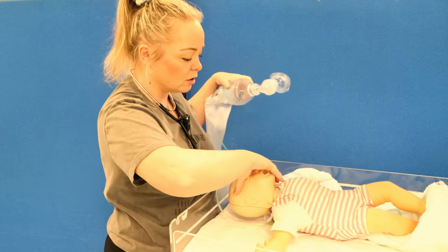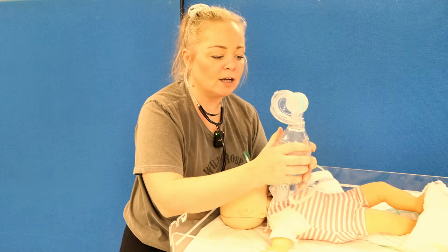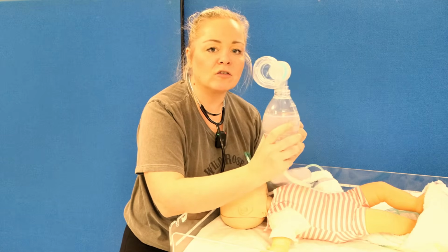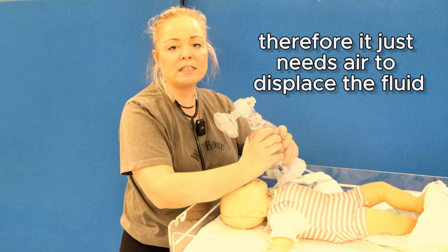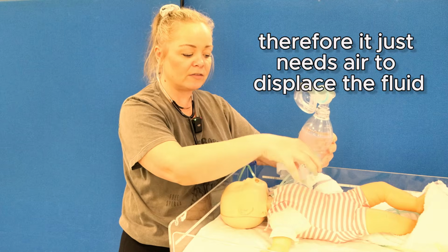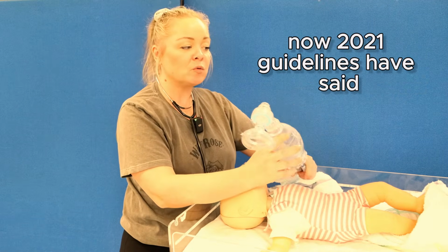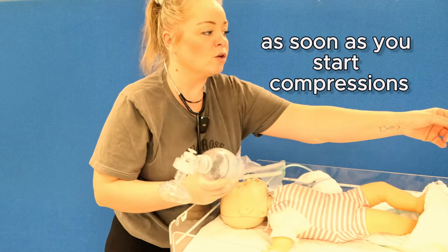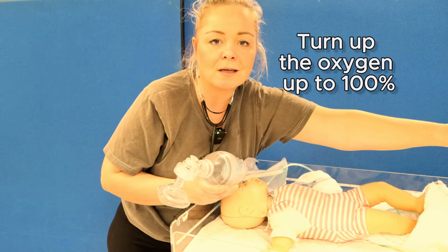One thing I haven't mentioned, the 2021 guidelines have changed. Prior to that, we would always use the bag valve mask on air because this isn't a cardiac arrest. Therefore, it just needs the air to displace the fluid and then give the oxygen some air to support the brain. Now, 2021 guidelines have said, as soon as you start compressions, you then turn up your blender for the oxygen up to 100%.